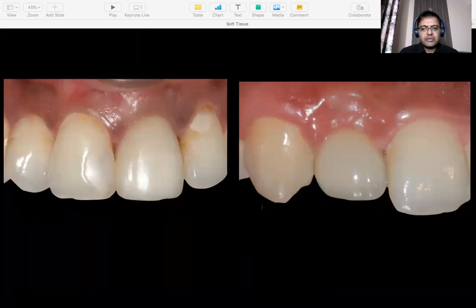And by the time we end up restoring these cases, that's what you see. You see a very, very healthy soft tissue because the buccal soft tissue was not changed. You would observe that the mucogingival junctions on both of them are absolutely fine. Okay, the gingival zeniths look good, the interdental papilla between the implant and the natural teeth look good, and that's what we want. We want beautiful looking hard and soft tissue outcomes around these implants. So what we did, we used epithelialized pedicle grafts to cover these extraction sockets.